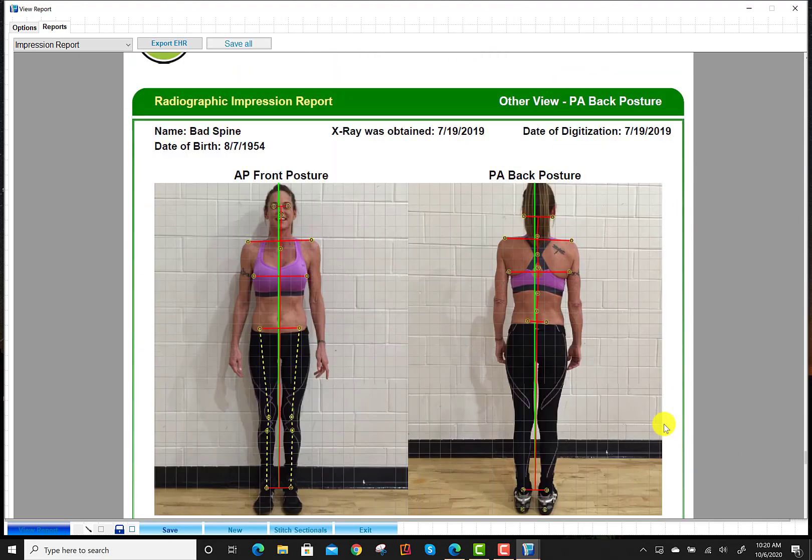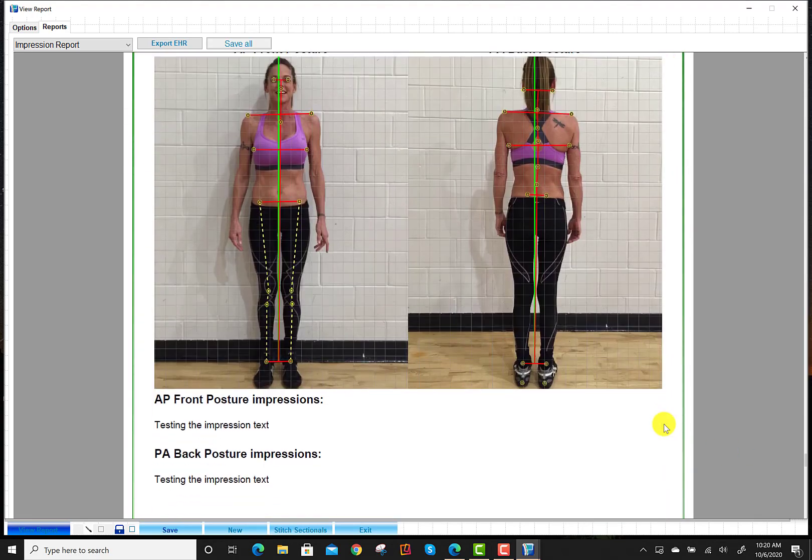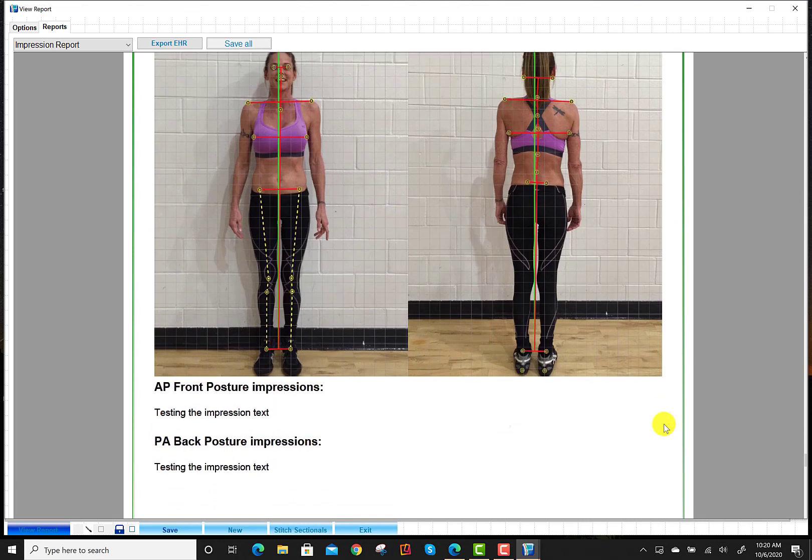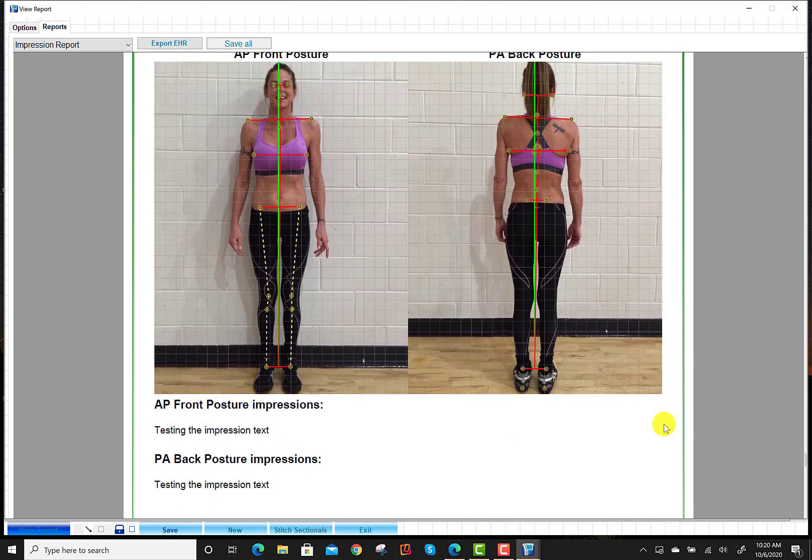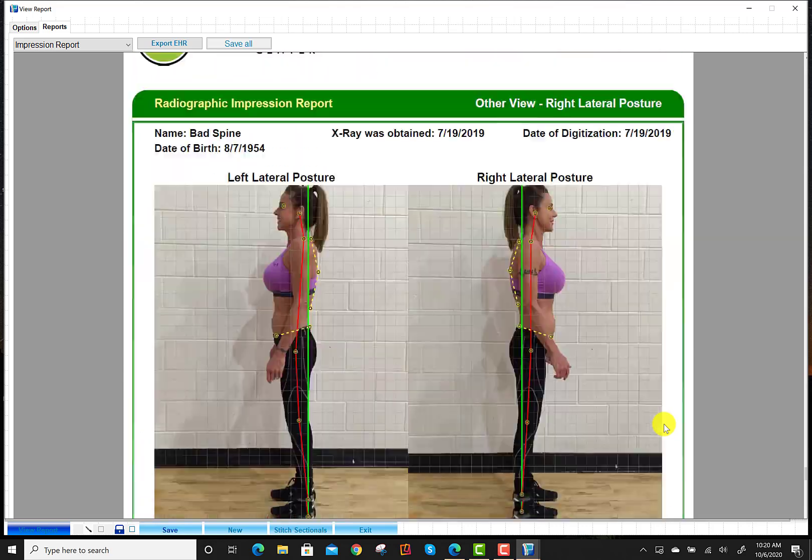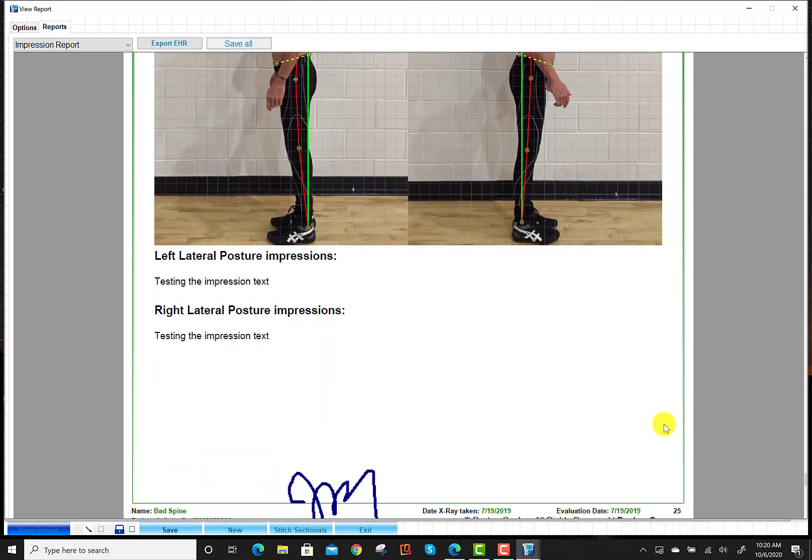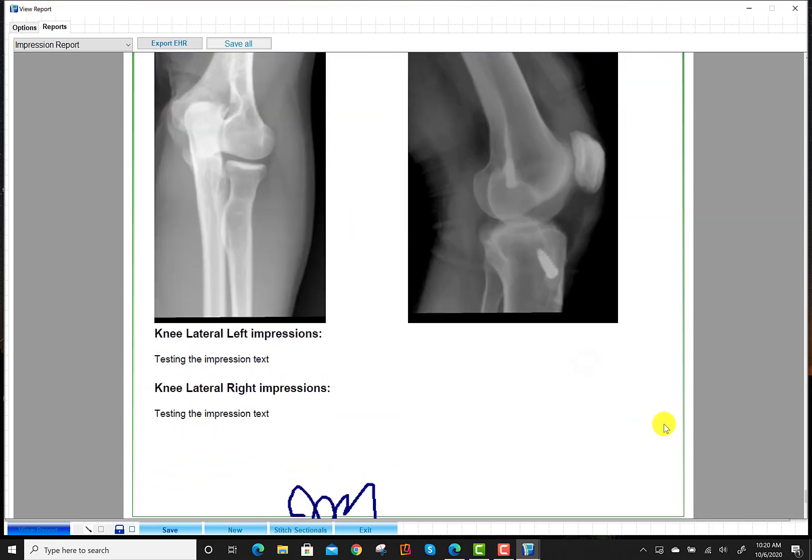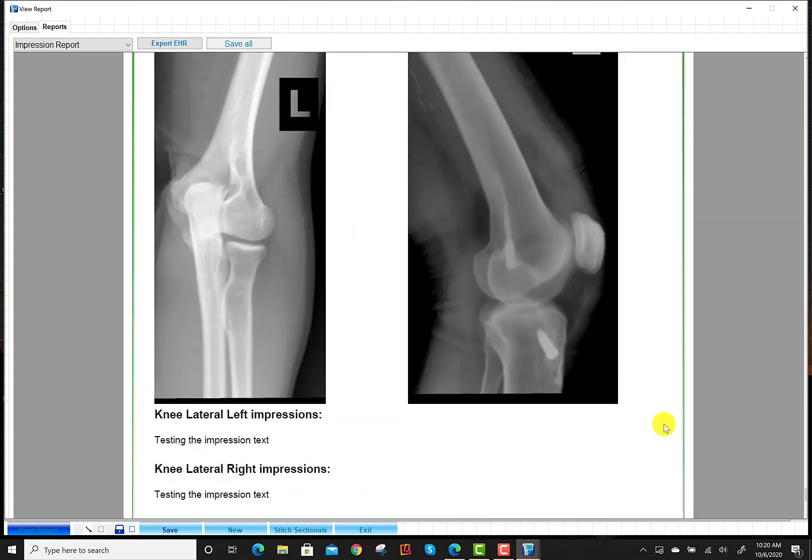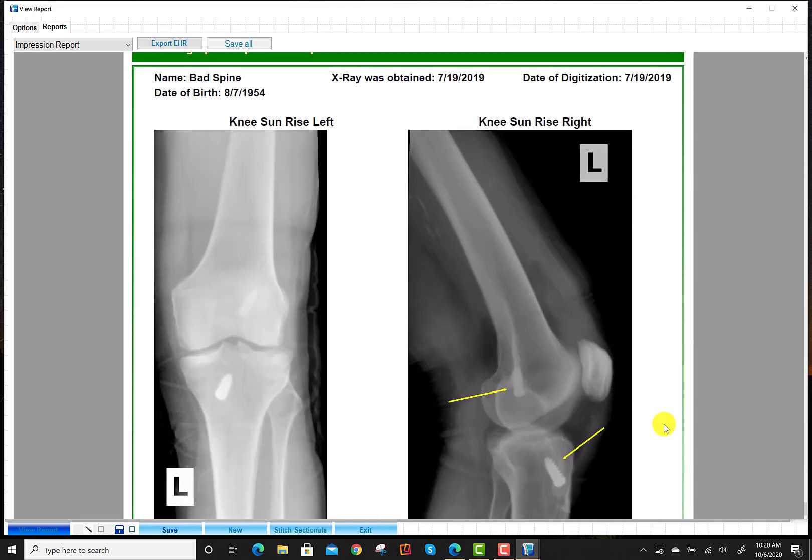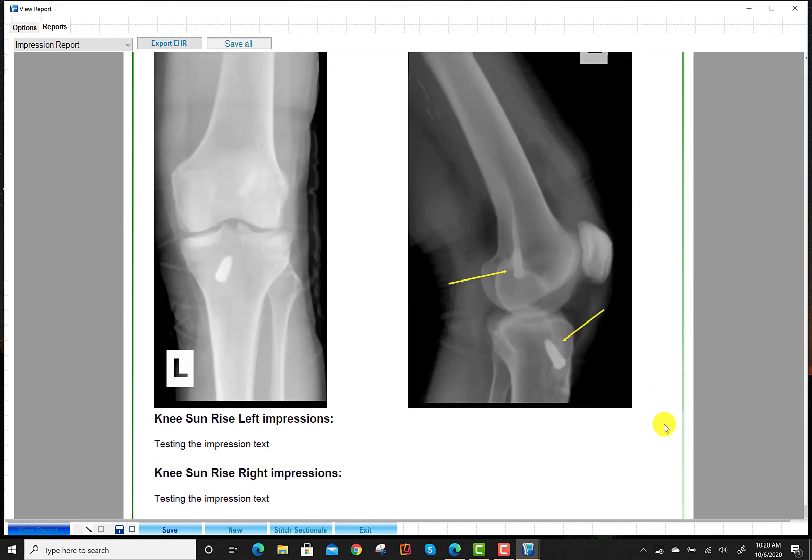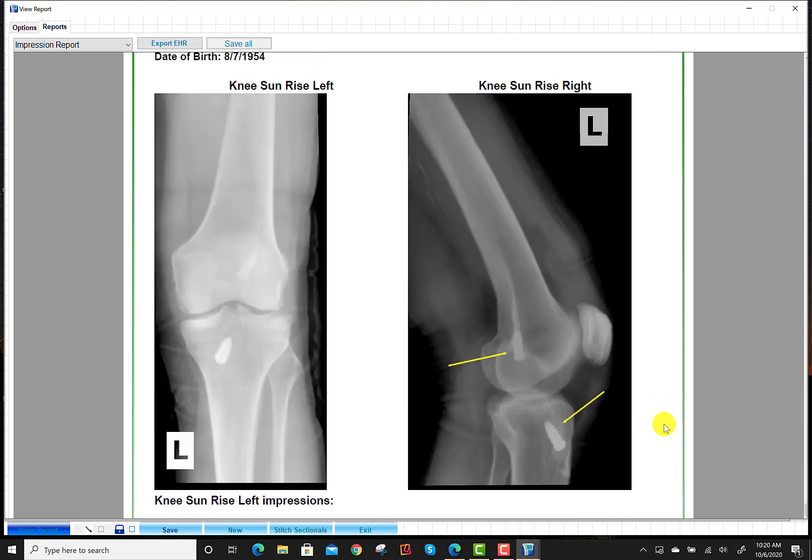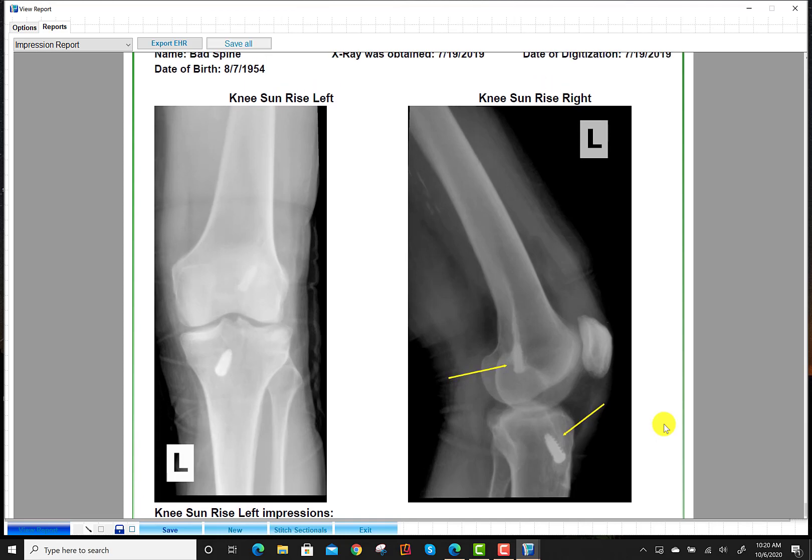So we can put that text right there. And then if I come in here, even under the posture. Of course, you're going to have the posture screen report, but you can write additional information based on their posture views if you load those in. And then you have the additional views. And there's the arrows as well, too, because we chose to generate the reports with annotations.